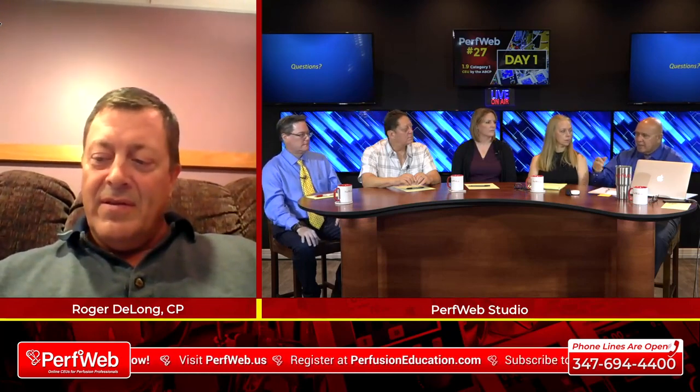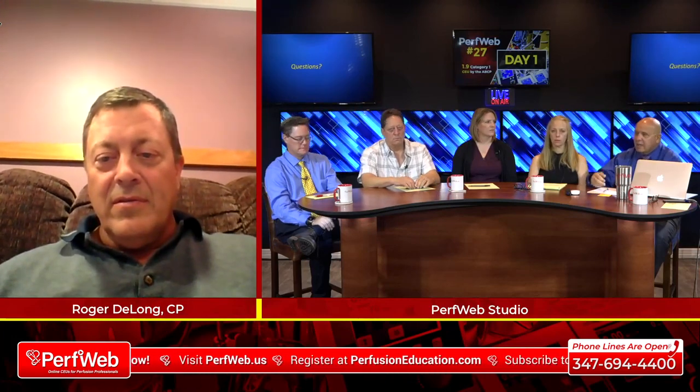Now, the other thing is, to the point, and I understand your change out's a half and all that stuff. Of course, I believe in changing the oxygenator circuit and everything else at 5 days, whether it needs it or not. But that's based more on what I recognize, and I may be onto something for the wrong reason. I'm not sure. But based on everything you told us today, I strongly suspect that changing the oxygenator, even one that has extended durability with the PMP fibers and stuff, probably should be changed because there's more clot burden in it than we ever really realized.